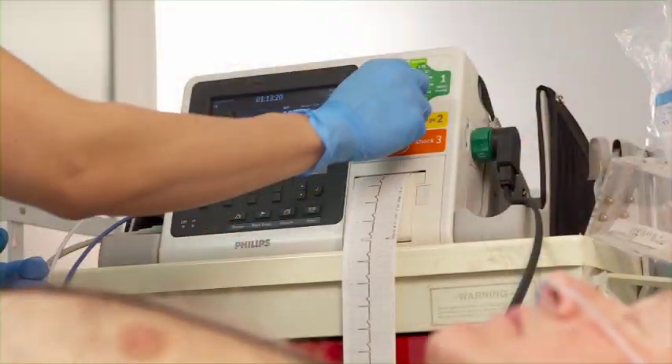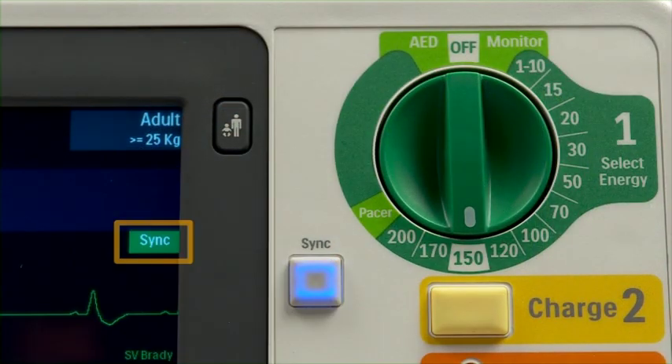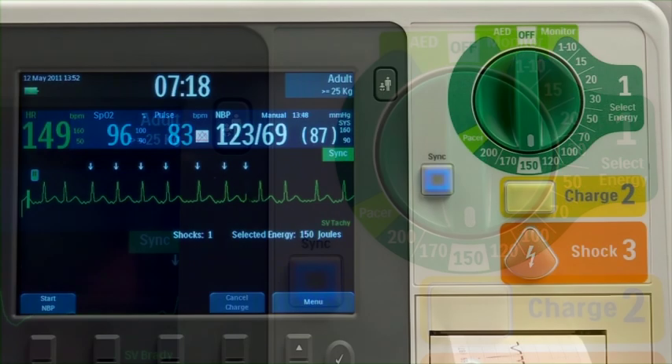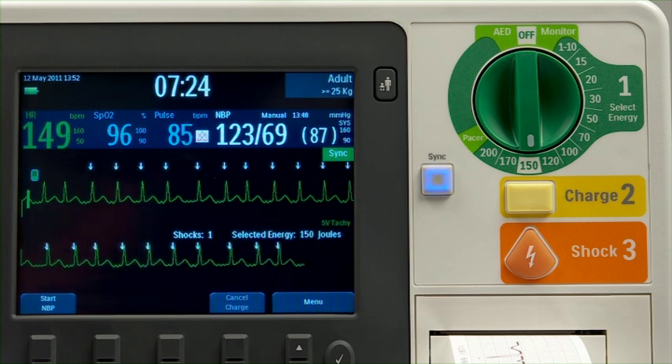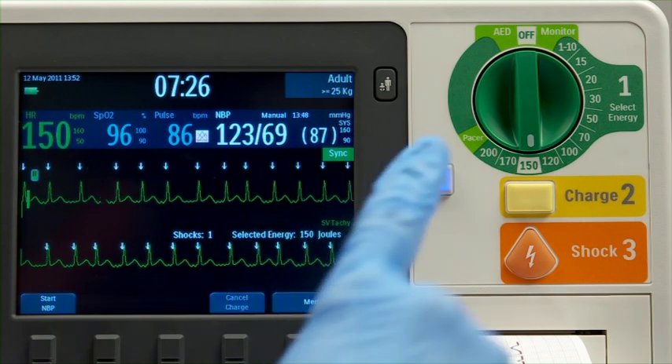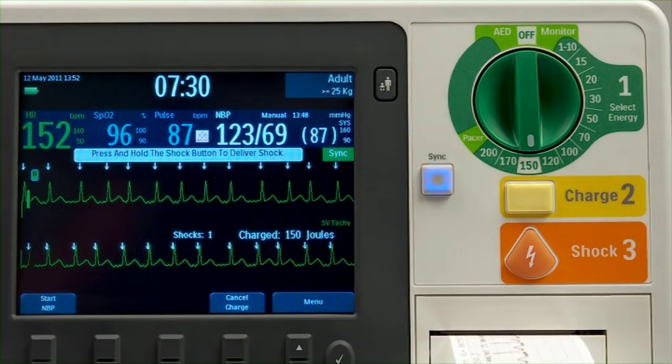Turn the therapy knob to the desired energy level setting and press the sync button. This message appears and the backlit sync button illuminates, indicating that sync mode is active. Confirm that the R wave arrow appears only with each R wave, signifying R wave detection.